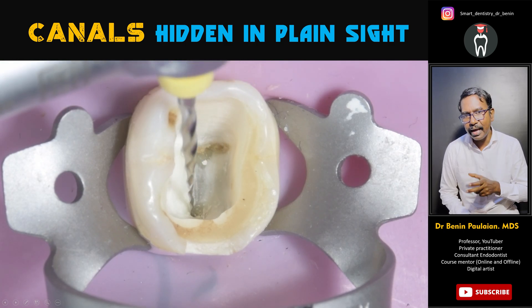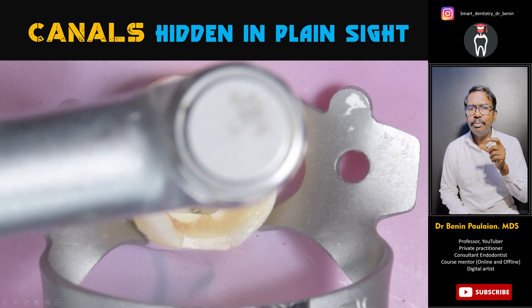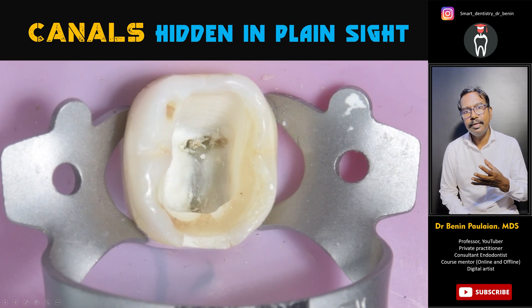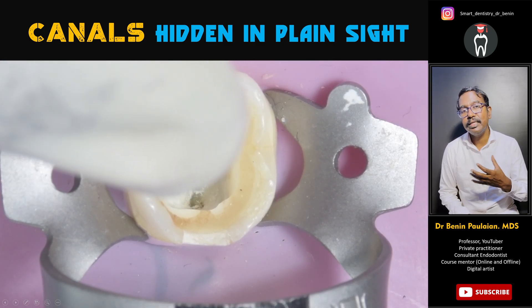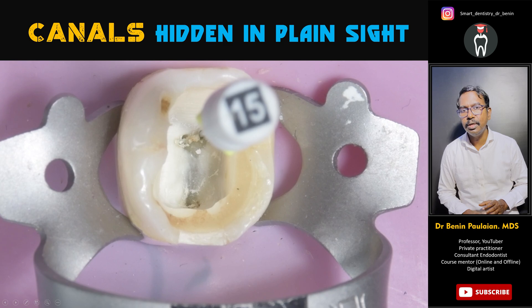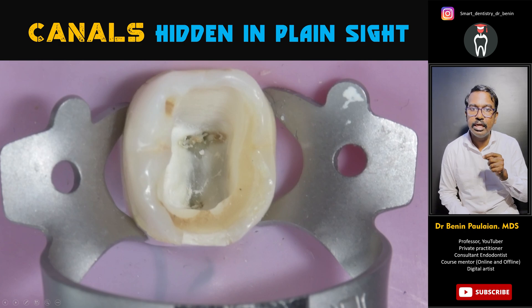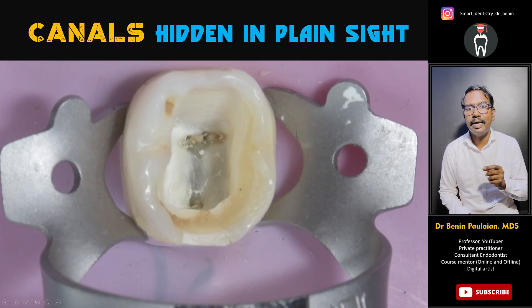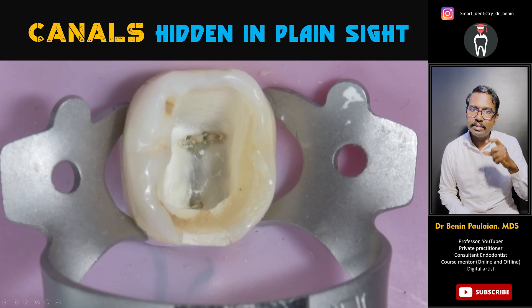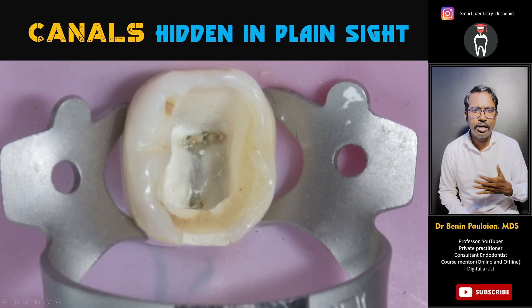We need to use a ProTaper Universal SX file. With the DG16, scratch on the pulpal floor; it will get caught at locations where orifices are present. Then take the ProTaper Universal SX orifice opener and insert the file four to five millimeters — not deep inside. Then you can proceed with the regular cleaning and shaping procedure. If you follow this technique, the cleaning and shaping will be much easier.